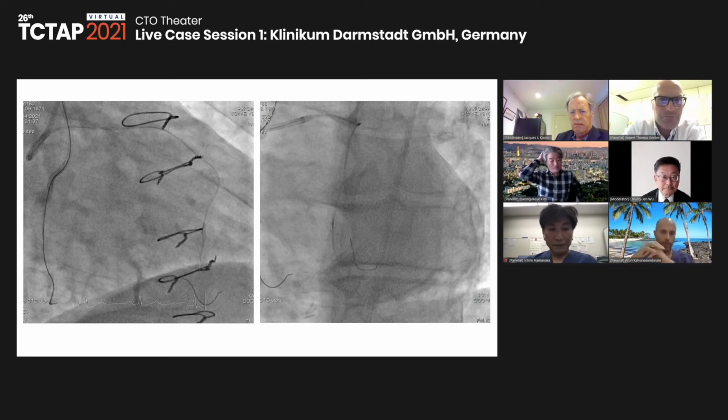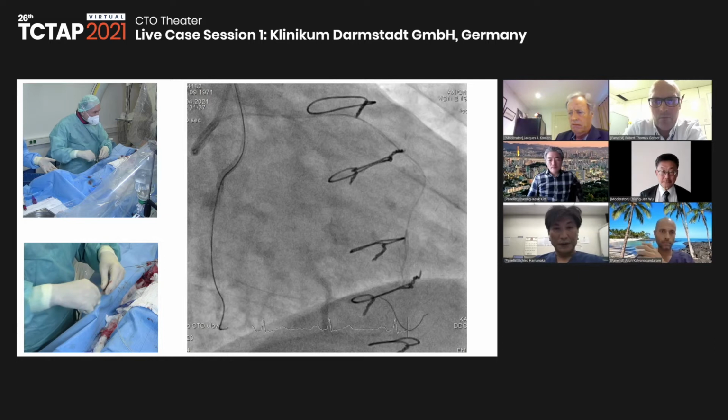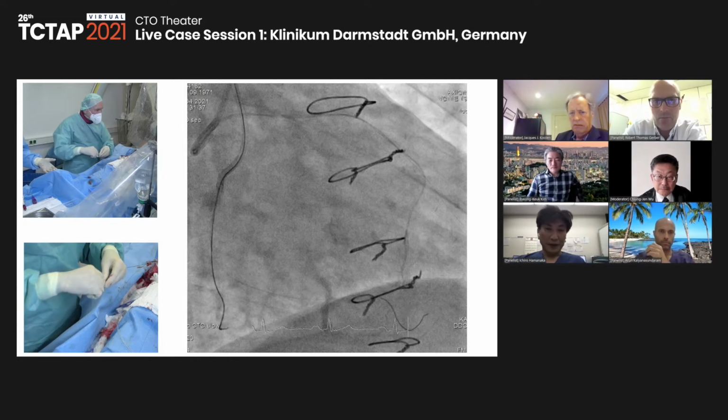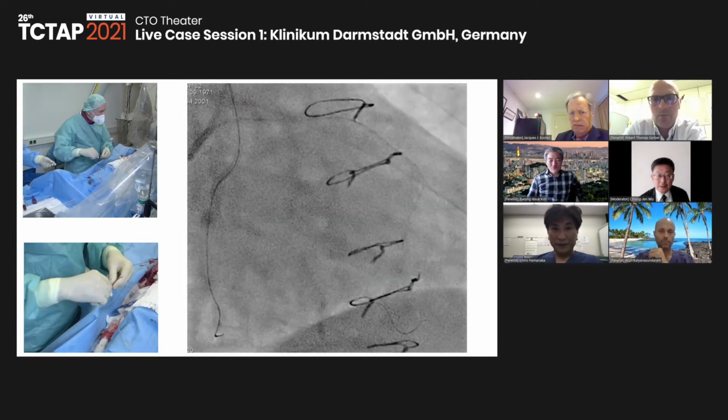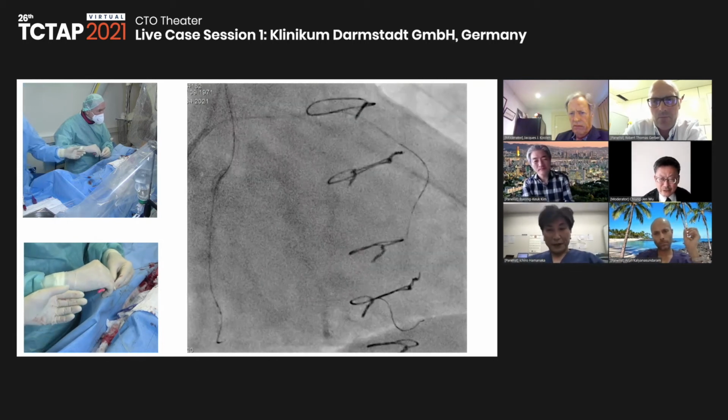But sometimes the Suo, especially in septals, I have the feeling that it might not be pushing when the muscles contract. It's certainly for epicardials number one, and certainly more than 50–60% of our collaterals are done with the Suo. Your tip injection seems only a CC0, CC1 connection.